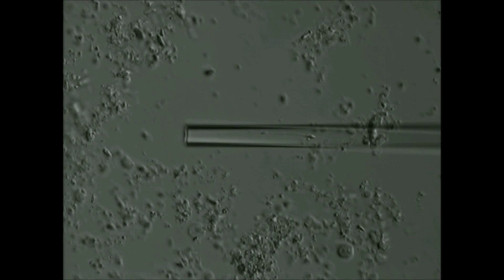Once the sperm is found and isolated, it is drawn into a microscopic biopsy pipette. Here you can see such a sperm drawn into the pipette.